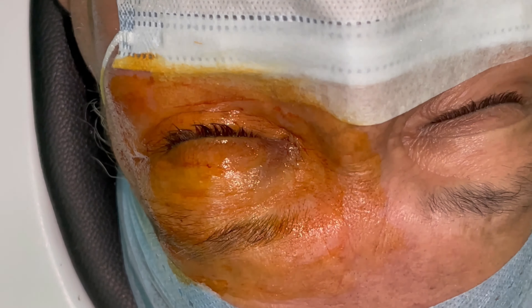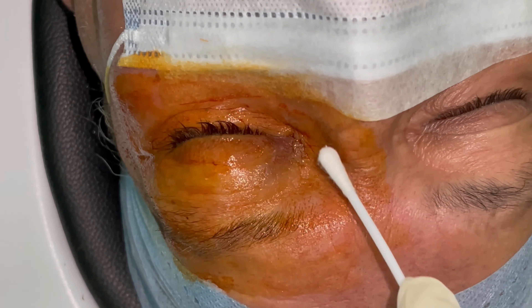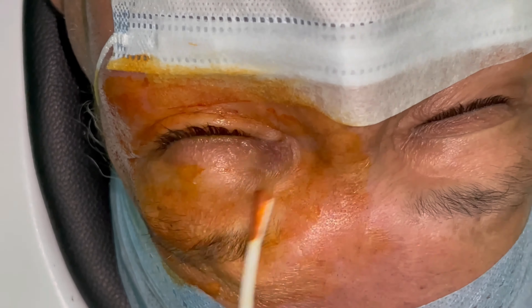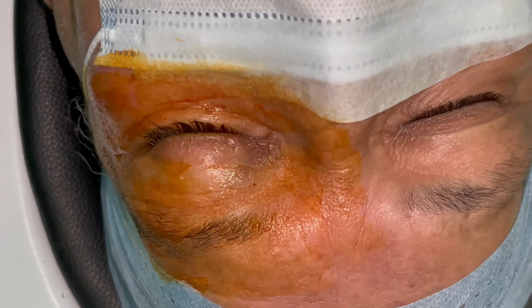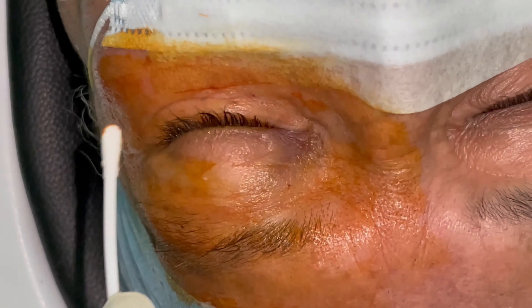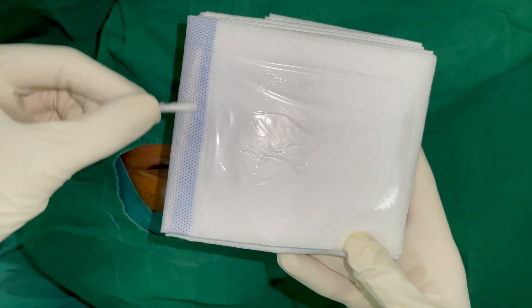It is extremely important that this area be dried completely. If it were not dried completely, it sometimes causes the drape not to adhere to the patient's skin, which gives unwanted exposure of the skin and all the lashes. As you can see, the area that is blue and has the metal clip is the part that houses the bag.